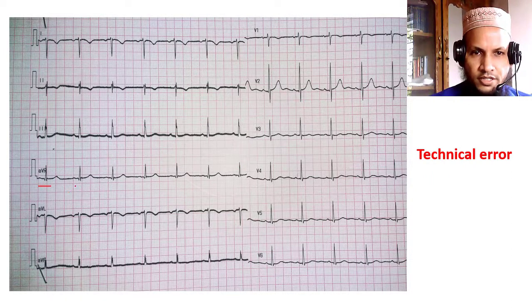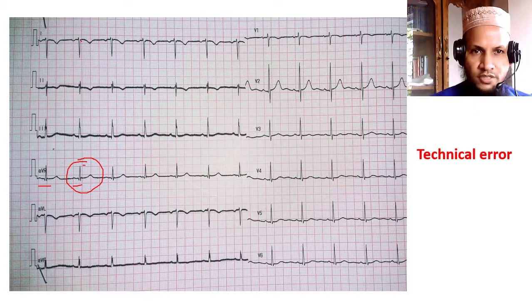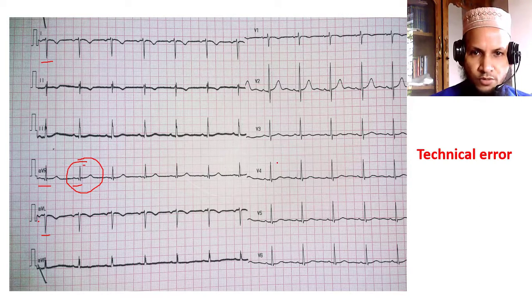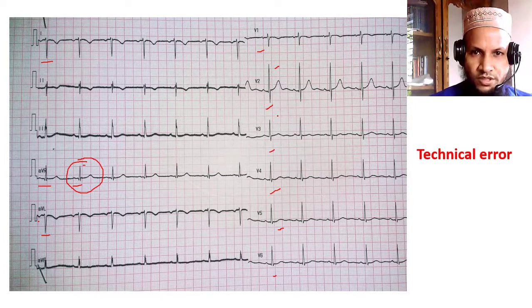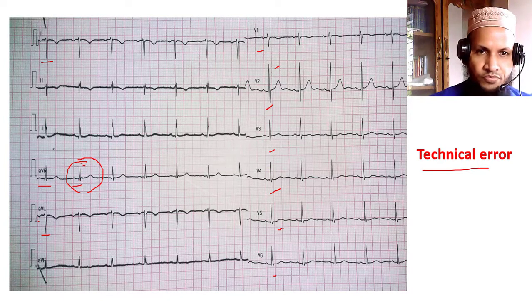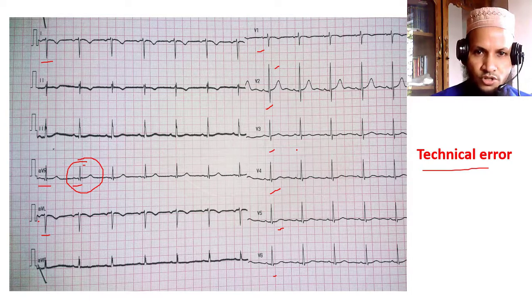In this second ECG, the P and R waves are positive in AVR, which may be due to technical error or dextrocardia. Looking at lead I and AVL, the P is inverted and the R wave is predominantly negative. However, in the precordial leads there is no reverse progression — it is almost normal progression, though there is some abnormality: the R wave in V2 is abnormally tall relative to V1 and V3. This is due to technical error. In technical error, we find positive waves in AVR and negative waves in leads I and AVL, but no reverse R wave progression in precordial leads.